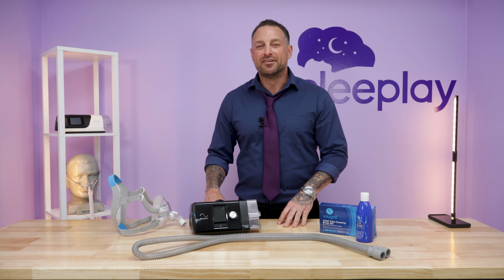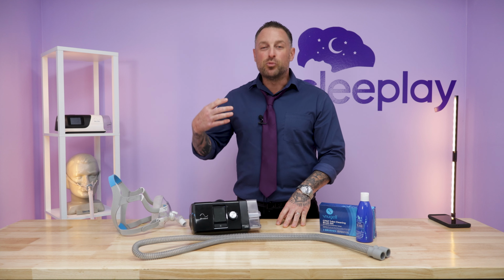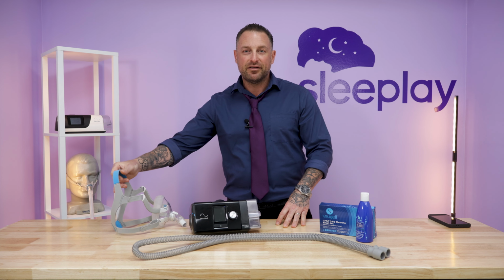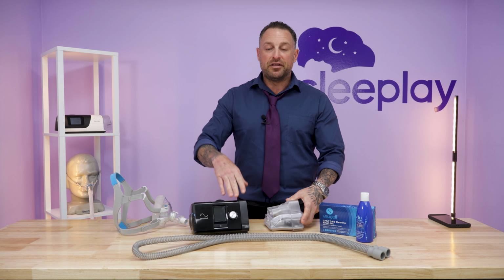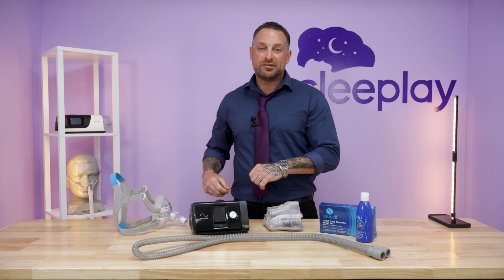So after the cushion, let's talk about what you're going to be cleaning weekly. We have the headgear and the frame that's already separated. You've got the water chamber that you're going to pull out, and you're going to take the tube off the back of the machine. Now these things can be cleaned together. If you are using a tub or a rather large sink, you might be able to fit everything.